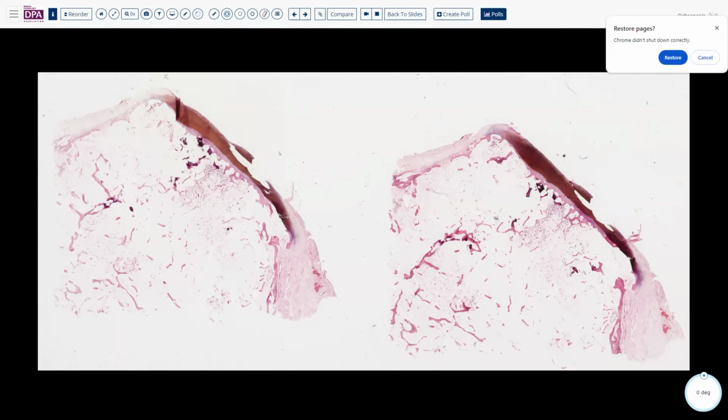So this is an elderly patient who had a joint replacement due to some degenerative symptoms, and maybe even a fracture.